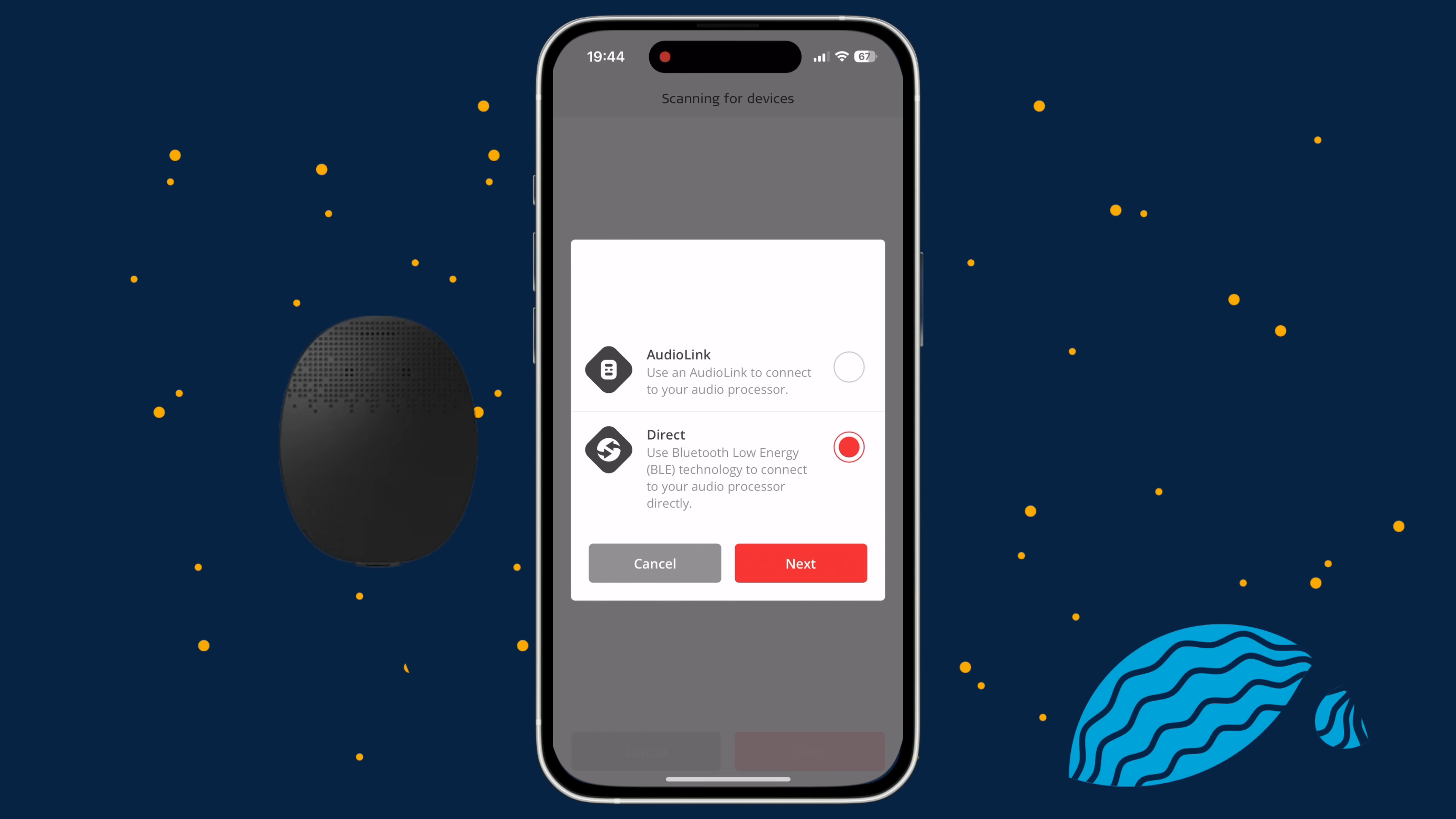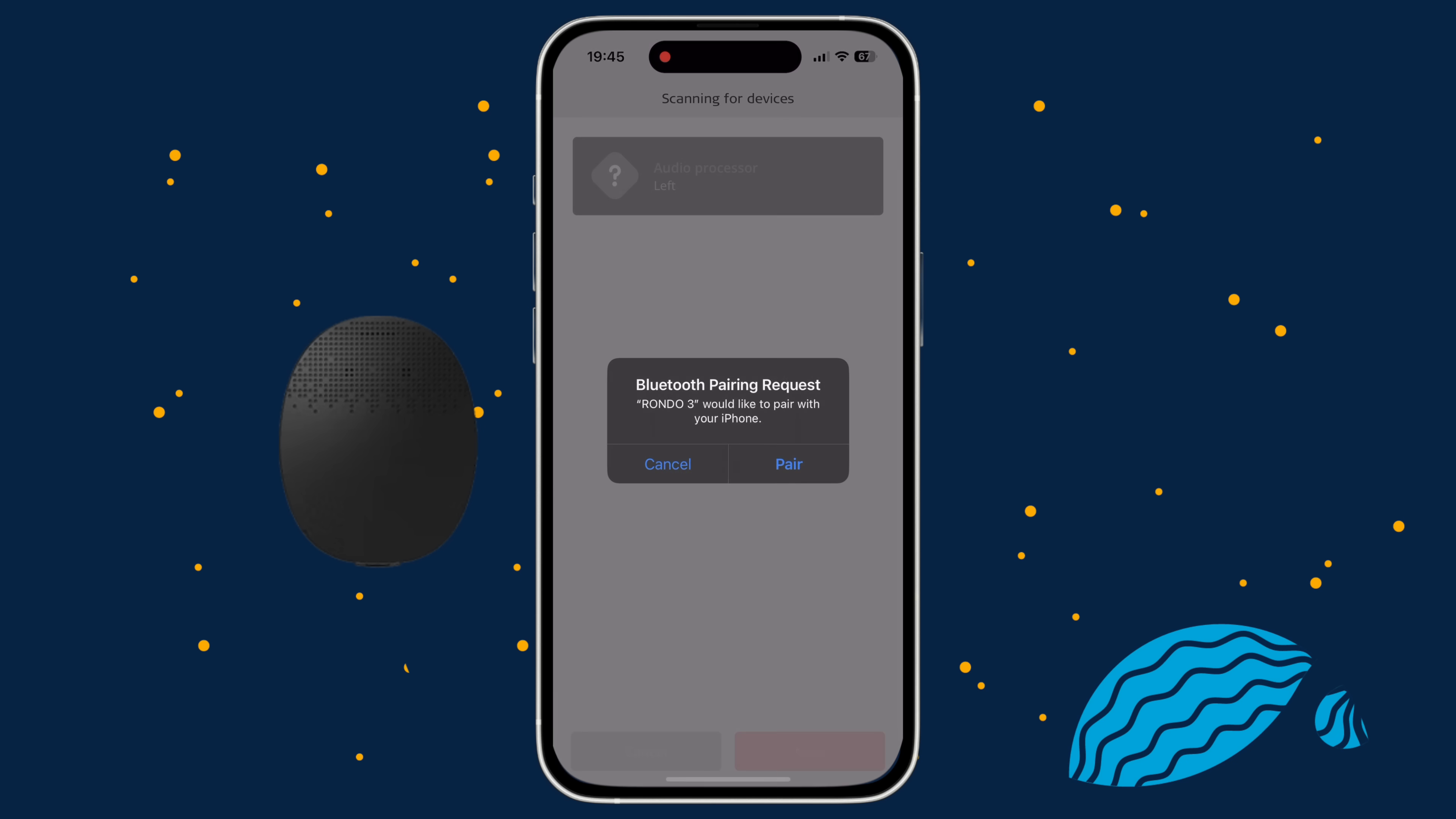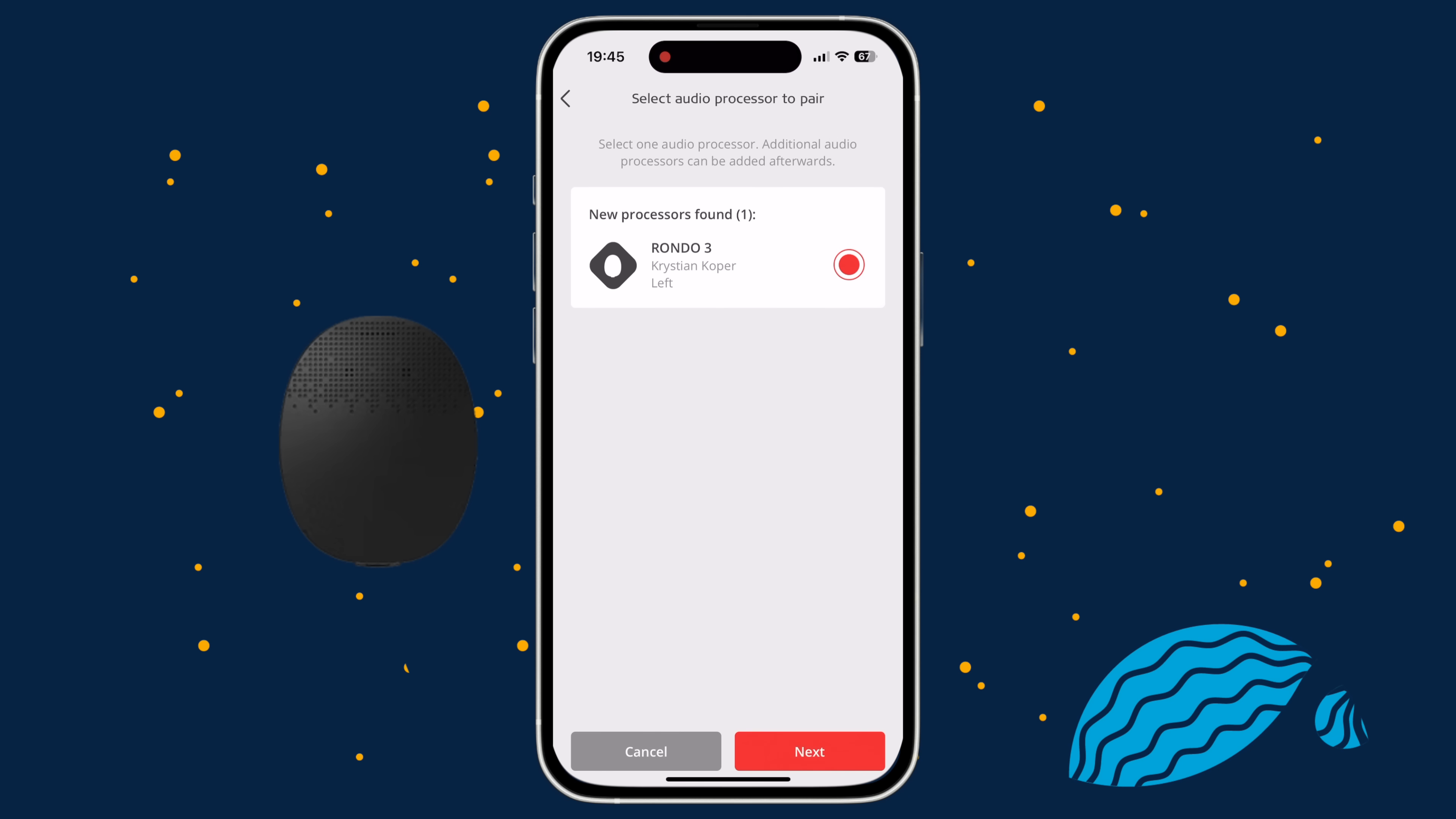If the pairing screen doesn't appear automatically, navigate to your profile and under Audio Processor, tap Pair Now. Turn Rondo 3 off and then on again. Then select the Direct Connection option and tap Next. Audio Key 2 will automatically pair with your device. Once your Audio Processor is paired, tap Next.